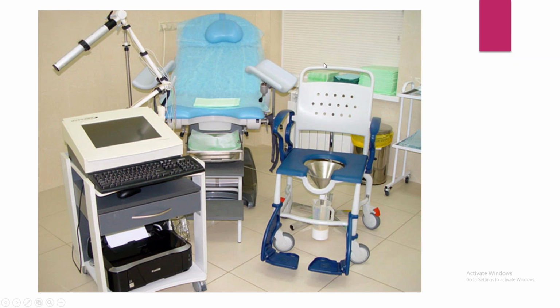Because when you ask the patient to void in it, you see this small jug. It usually has a rotating flow meter, so it will count the flow rate, and it will count the volume also. After this voiding, you are going to measure the post-voidal residue by scan, or by ultrasound, or by inserting a catheter, and then you will be doing the pressure studies.